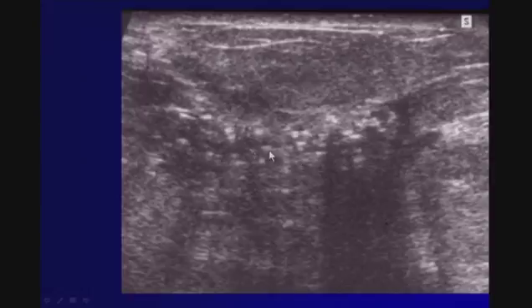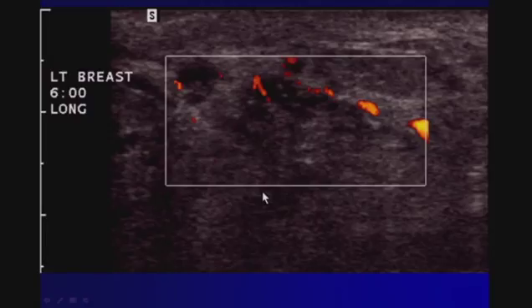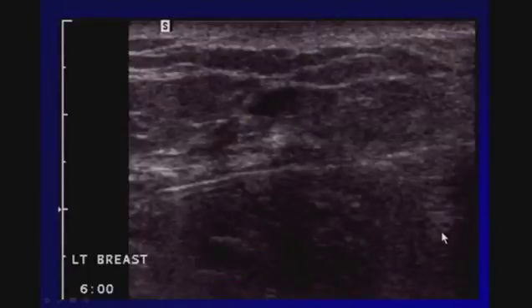Here's a similar case, calcifications, some with shadowing, marked calcifications. This was an example of DCIS with microinvasion. Somewhat similar case here. When we look very carefully, we see some calcifications. We see some rounded spaces, rather small. There is some flow with power Doppler around some of the rounded spaces. So this is somewhat suspicious. I'm going to try to biopsy the areas of calcifications with my biggest device or with a vacuum-assisted device and take multiple cores and then follow that up with a specimen radiograph. And that's what we did right here, and we came up with a diagnosis of DCIS with microinvasion.